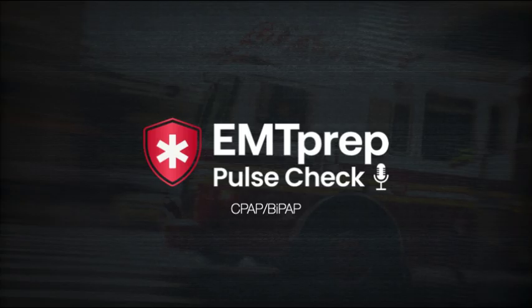Some of the devices we'll use in conjunction with a BVM are going to be an NPA and an OPA. An NPA is inserted through the nostril and prevents the tongue from falling back and obstructing the airway. However, it is contraindicated in head injuries. An OPA is inserted into the mouth at a 90 or 180 degree angle and rotated into place. Once again, this prevents the tongue from obstructing the airway. This will be contraindicated in patients that have an intact gag reflex.